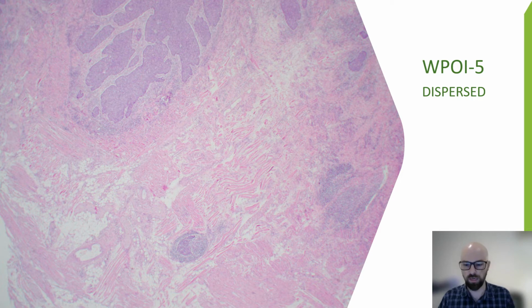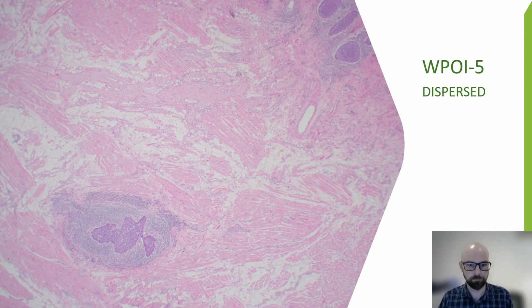And what comes with that is a poor prognosis. Tumours which have a pattern of invasion like this are more likely to have lymphovascular invasion, tend to get closer margins, and are more likely to have nodal metastases. And this is just another example of the microsatellite. So a bit of the main tumour focus here, and then a microsatellite well away from that main tumour.